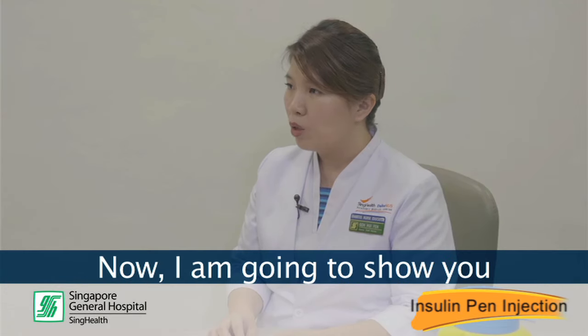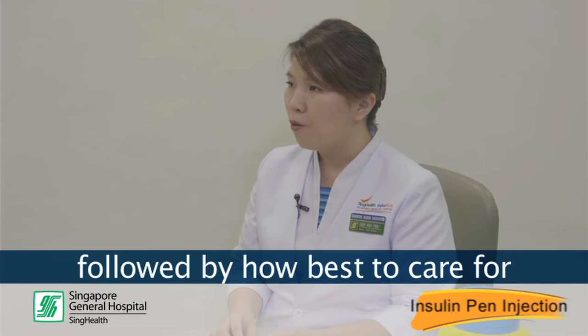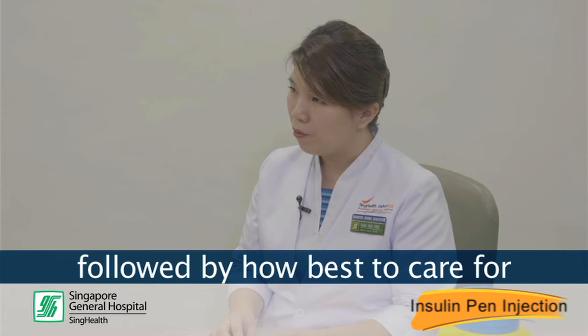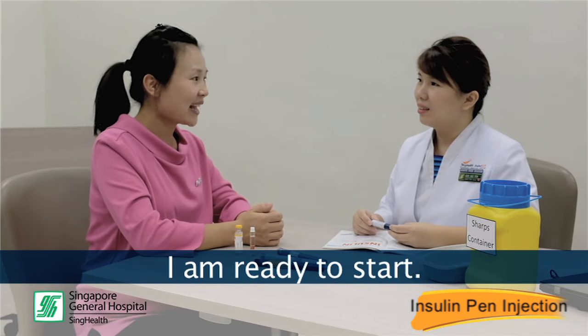Now, I am going to show you how to use this insulin pen, demonstrate the injection technique, followed by how best to care for and store the pen. Thank you for your explanation. I am ready to start.